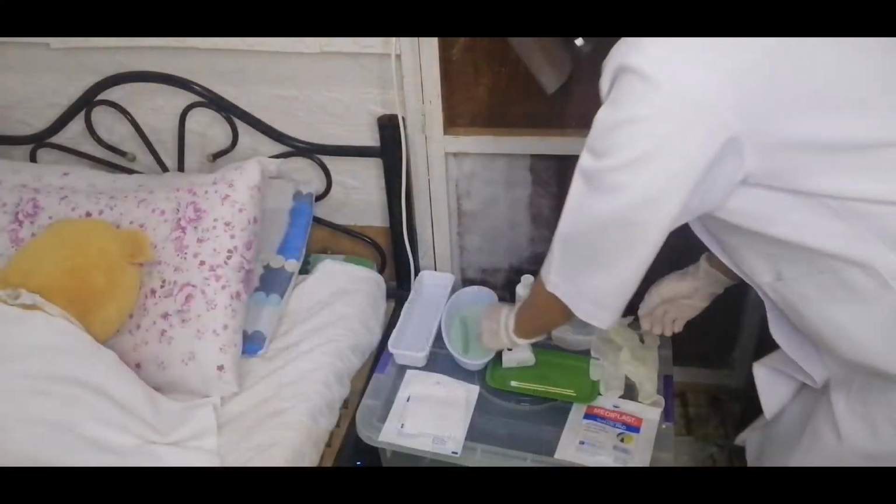Clean the inner cannula of the trachea tube using the prepared plain NSS plus hydrogen peroxide, and use brush to remove solidified or sticky mucus. Then rinse using the second basin with plain NSS only.